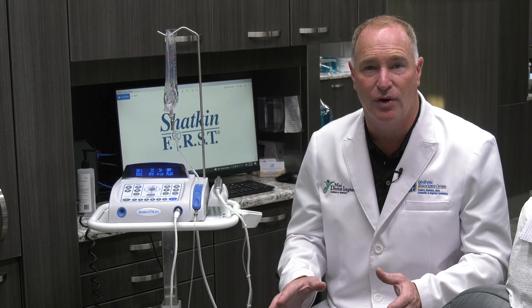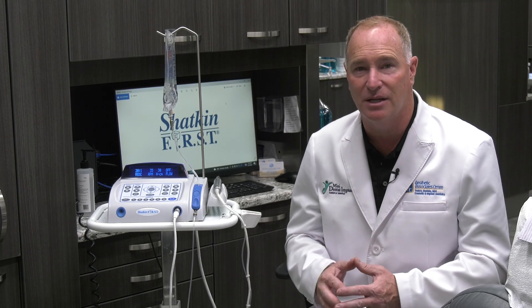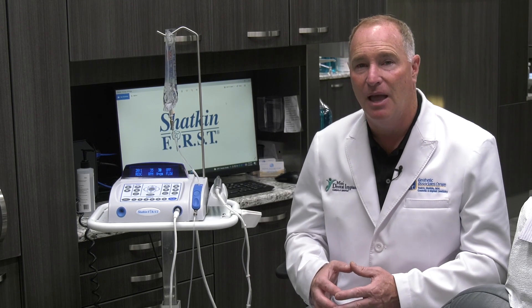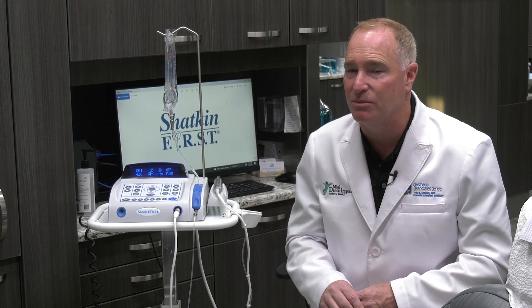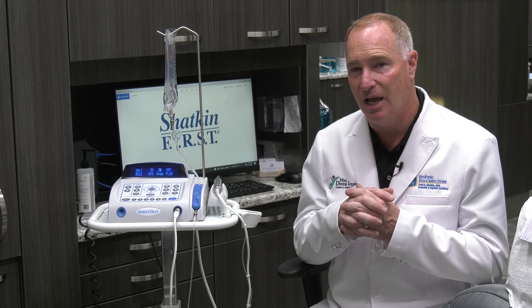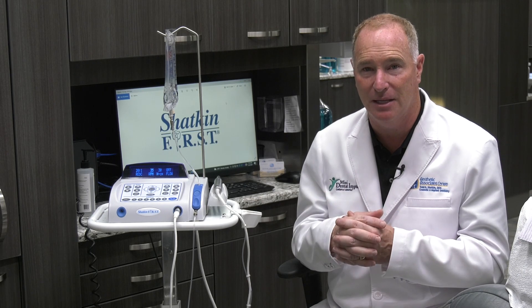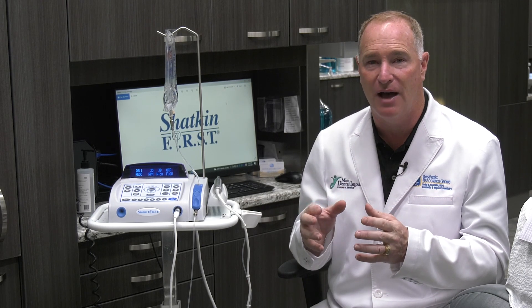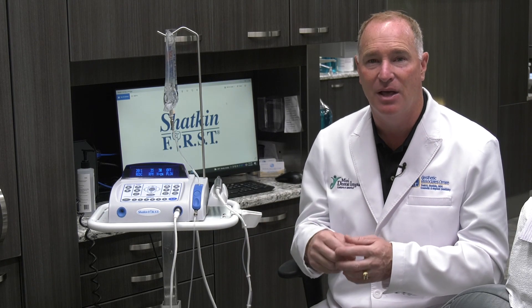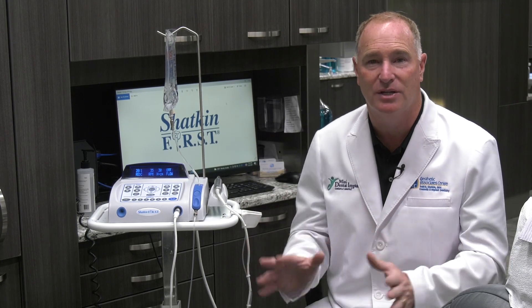If you have four implants and three out of four reach over 30 and one doesn't but still seems solid when you tap on it with your mirror handle, you're okay to cement your final bridge on that. If it's a single tooth and you don't get 30 newton centimeters of torque, do not put a crown on it. Usually I'll take that implant out and go to a wider diameter immediately — up to a 3.0 or 3.75 — and 99 percent of the time you'll reach that 30 newton centimeters with a wider diameter implant.